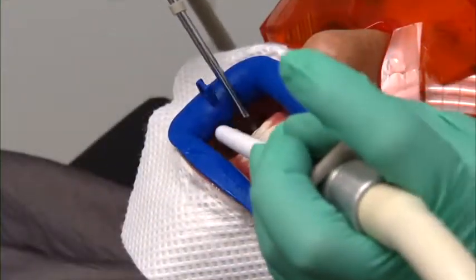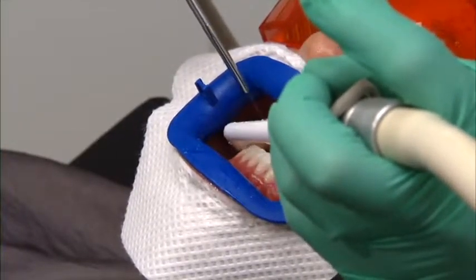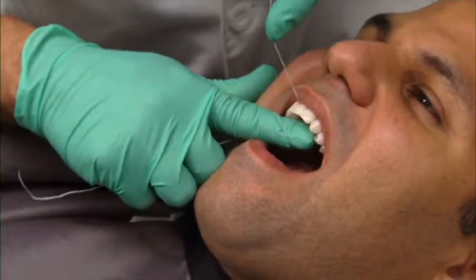Completely rinse the teeth and irrigate the oral cavity. If liquidam remains interproximally, remove it with floss.